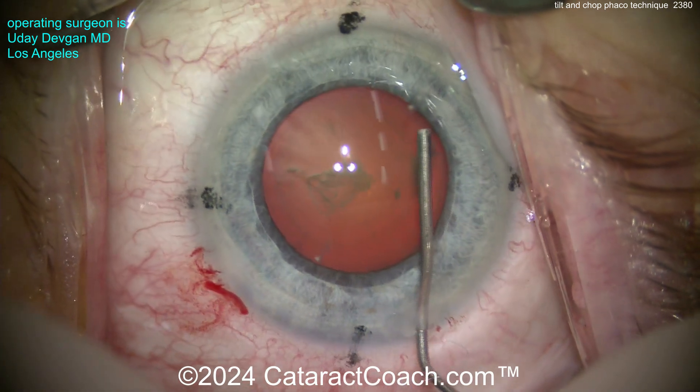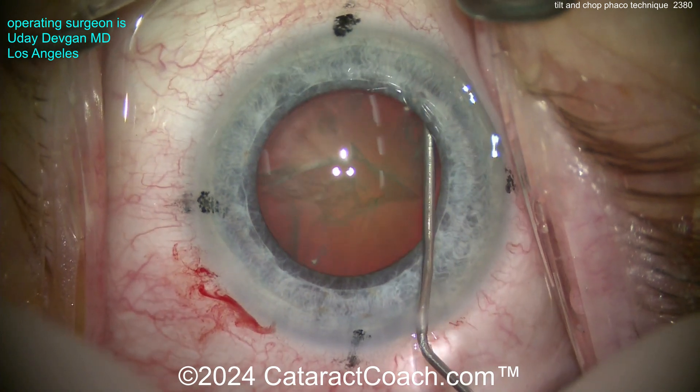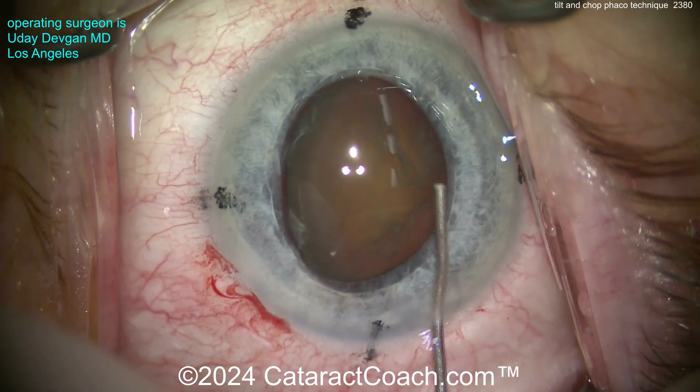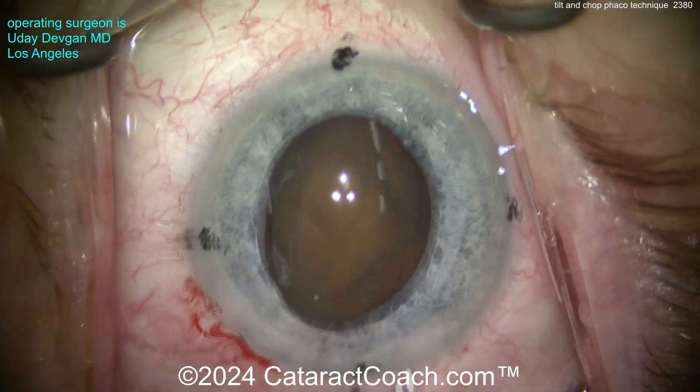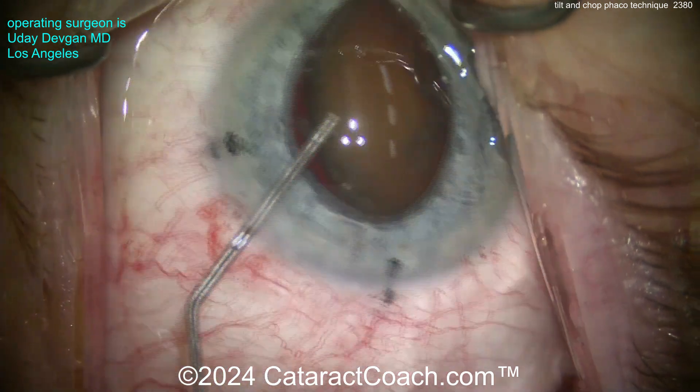Now here's the key for the hydrodissection: put the cannula to the side — the left or the right, here to the right side — slow and steady on the hydrodissection, not forceful. The nucleus will slowly prolapse out of the bag as you inject more and more BSS. There it is — the nucleus tilted on its side.